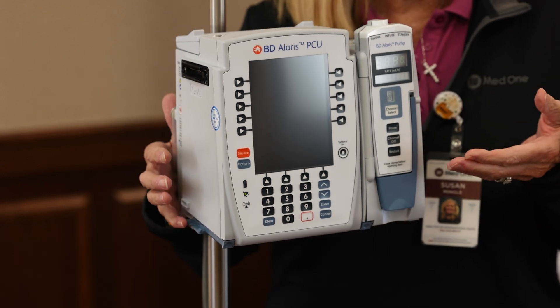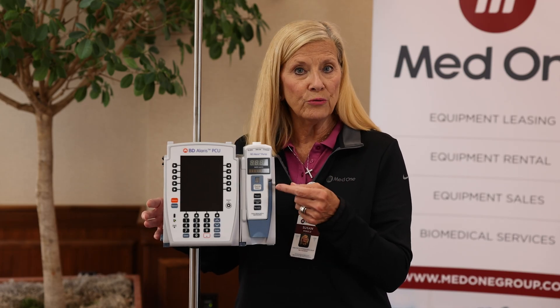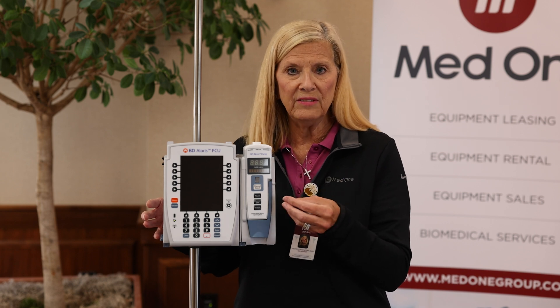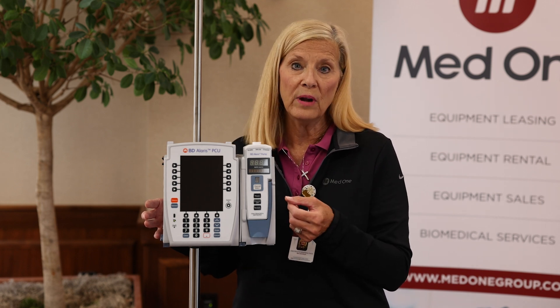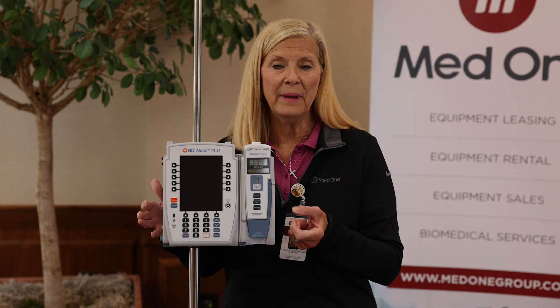Now you can access, using the large volume pump module, the guardrails drug library, so you will have the safety software when you're programming your infusions, which helps reduce medication errors at the bedside.